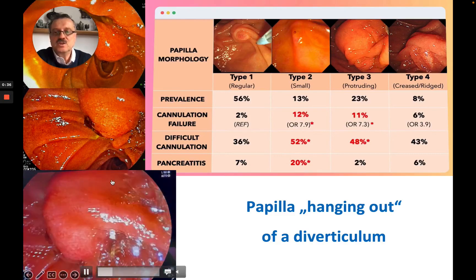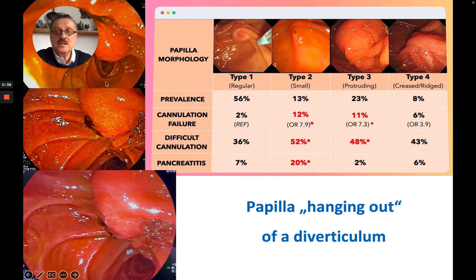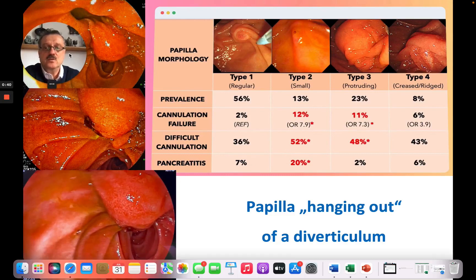This papilla was quite bulgy and it really was hanging out of a diverticulum. At the bottom of the papilla one could see blood. So likely a stone had gone through, but on endoscopic ultrasound there were more stones in the bile duct.